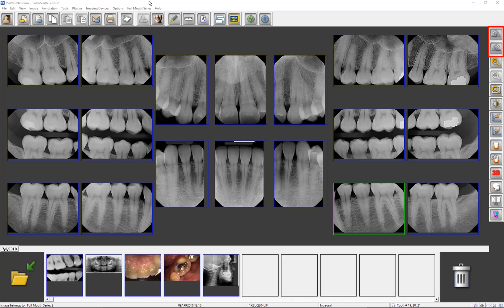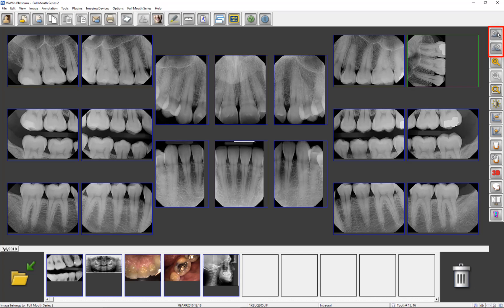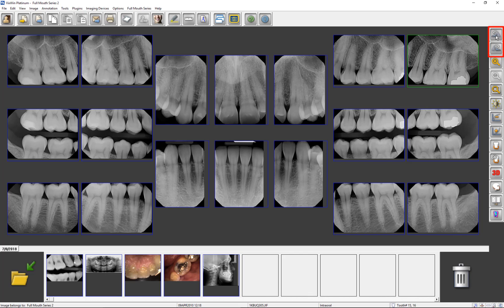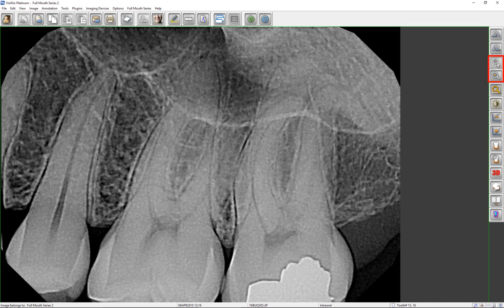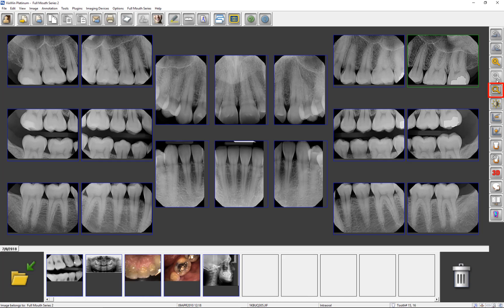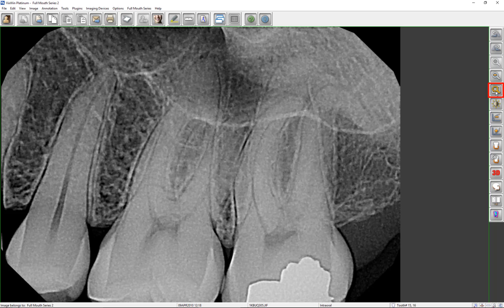On the sidebar, the top two buttons allow the user to rotate images 90 degrees to either the left or the right. The magnifying glass with a plus sign will enlarge a selected image to full screen. The magnifying glass with a minus sign will return an enlarged image to the mount. The magnifying glass with no plus or minus will fit an image to screen and return the image to the mount.